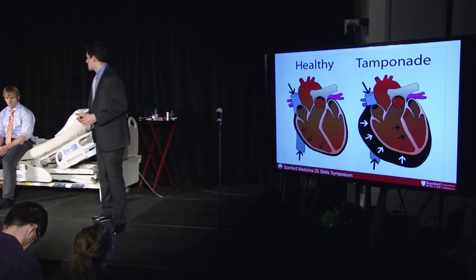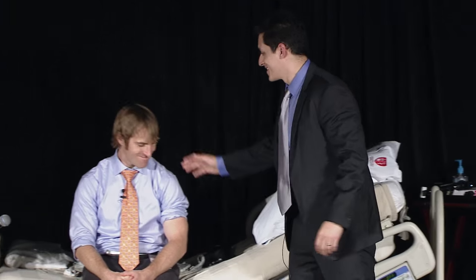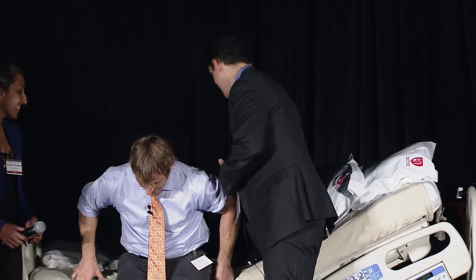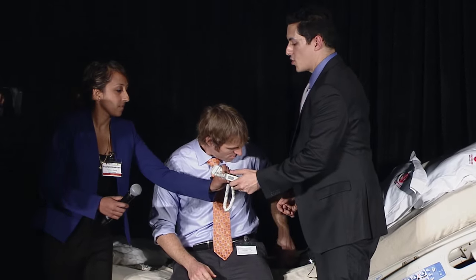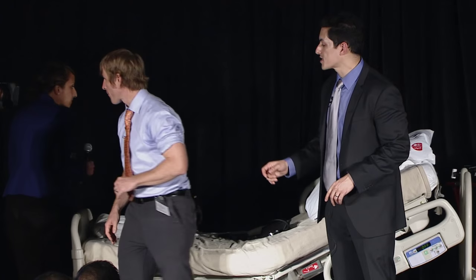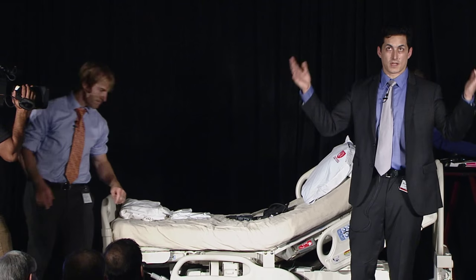We're going to demonstrate how to measure for pulsus paradoxus. We'll first measure John normally without pulsus paradoxus, and then we're going to give him pulsus paradoxus and measure again to show how we pick it up. Normally for pulsus paradoxus, all you need is a stethoscope and a blood pressure cuff, but for this demonstration we're using a Doppler instead of the stethoscope so we can put the sounds up for the whole room.